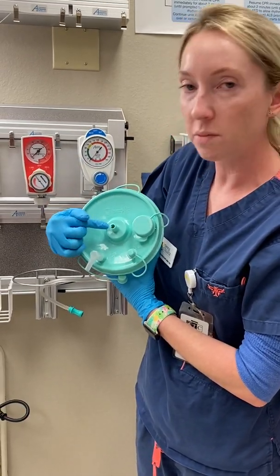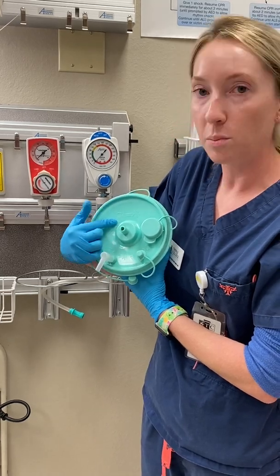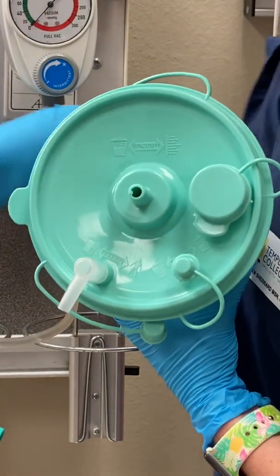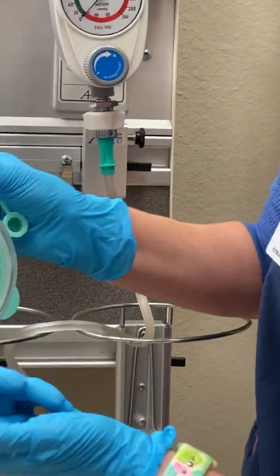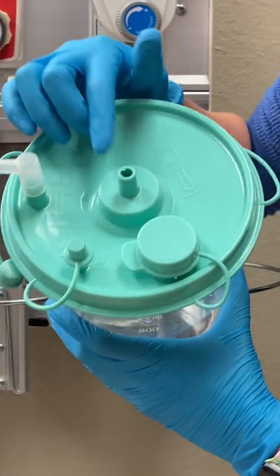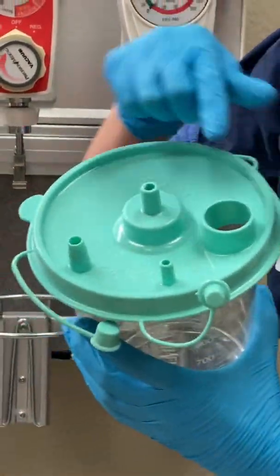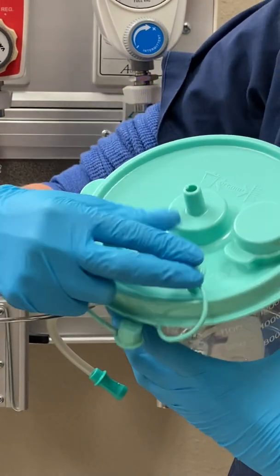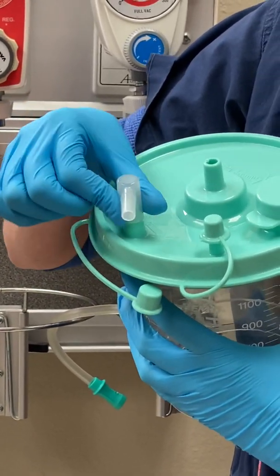There will always be a specific port for your vacuum — it's typically in the center, but it will have a label that says suction, vacuum, regulator, port, etc. It's very important to hook your suction regulator directly to this port because the lid has a filter, which prevents anything in the canister from being sucked up through this port. Then you've got a variety of other size ports — this one says tandem, this one says patient. Any regulator tubes you don't want to use, you'll cap off. Go by your facility's policies.